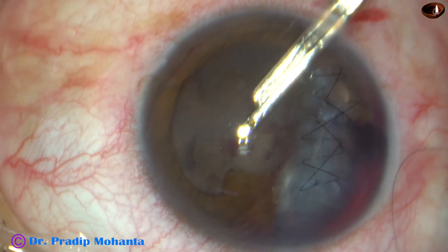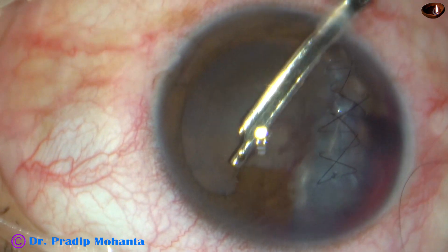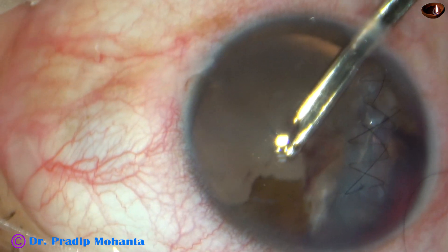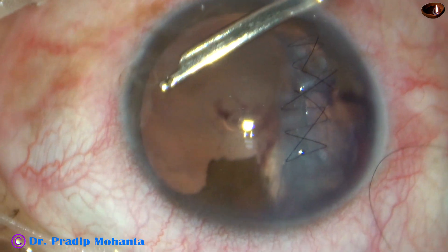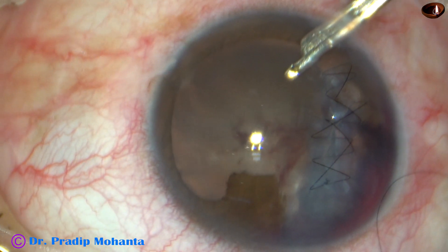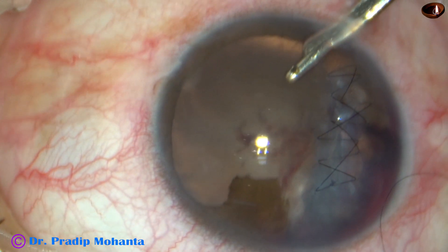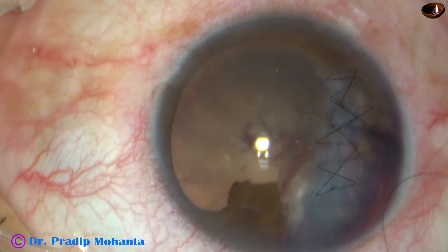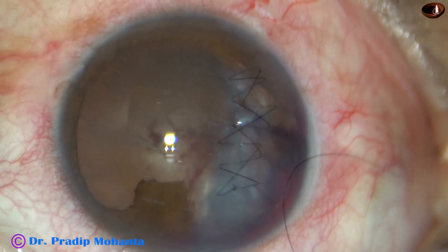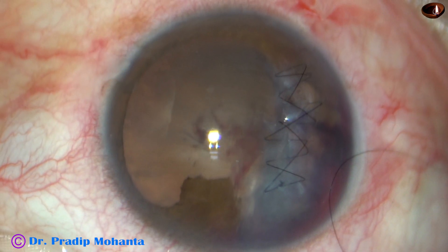You can see some red glow, and I hope the posterior segment is okay. The lavage is almost done. There's some clot at eleven o'clock. I don't want to disturb that clot at this moment — we don't know what the situation is there.